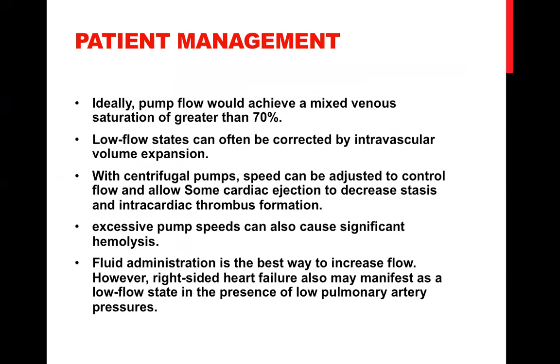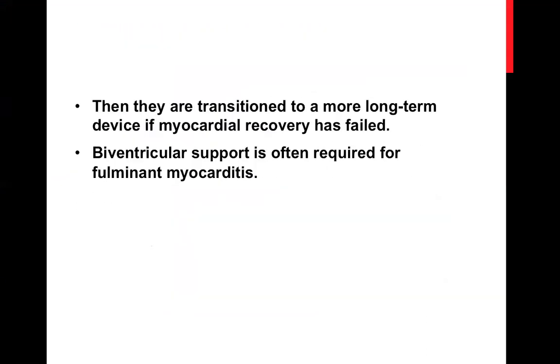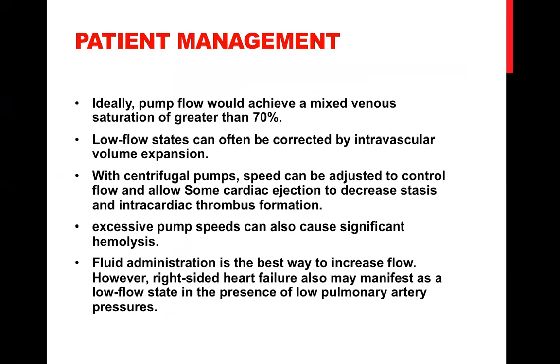So especially the CP, it's not a big flow. It tells you 3.5, but what I've seen, it's maximum 3.4 that it gives. According to the patient size, you can have a patient of 50 kilogram, that's perfect, that's a full flow. But if you have a patient of 90, that's not even barely half flow. So you're not going to have the proper effect, especially if he or she is that big.